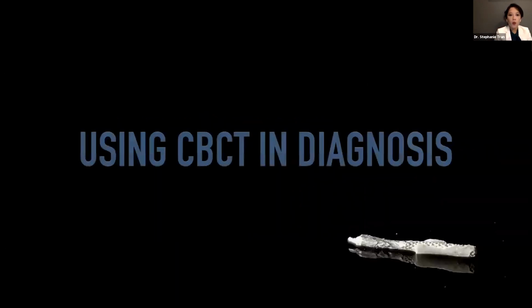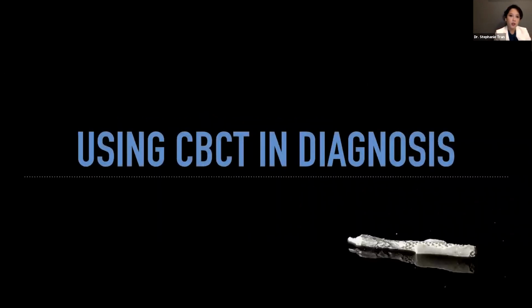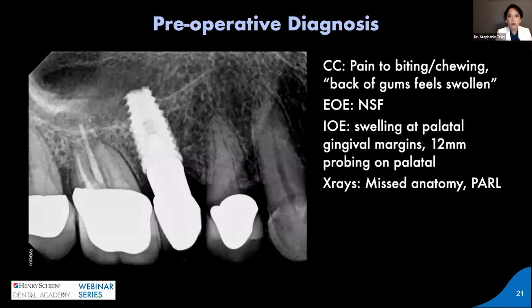Because the CBCT is so complex in diagnosis, I'm going to go through some cases of how I evaluate the CBCT itself. In this case, this patient presented to me with biting and chewing tenderness, and the back of her gums felt like they were swollen, and that swelling would come and go. She didn't have extraoral swelling itself.